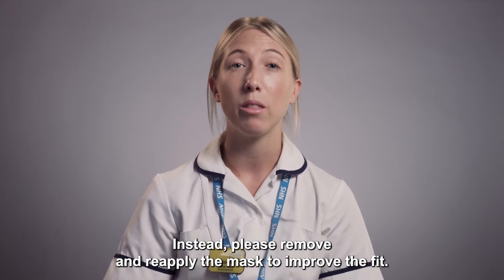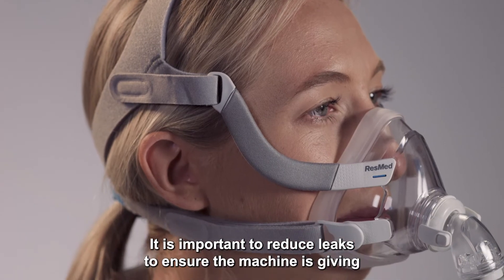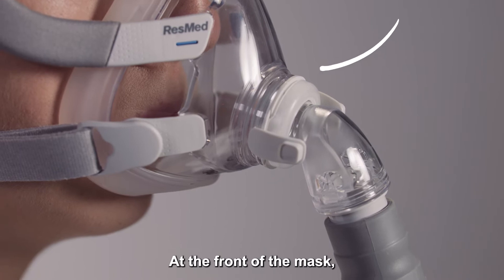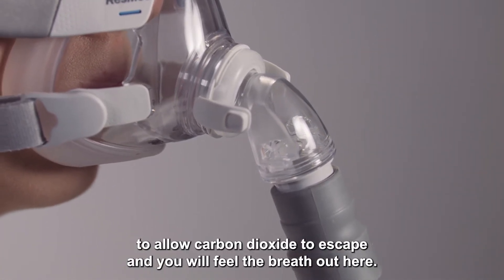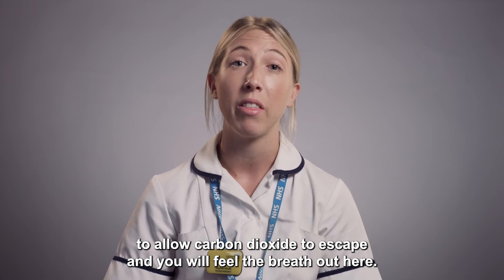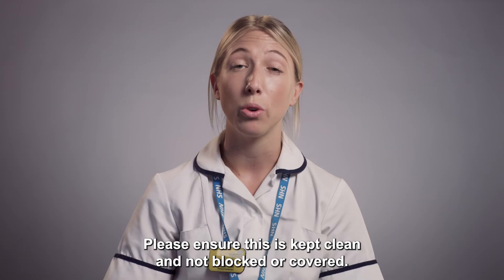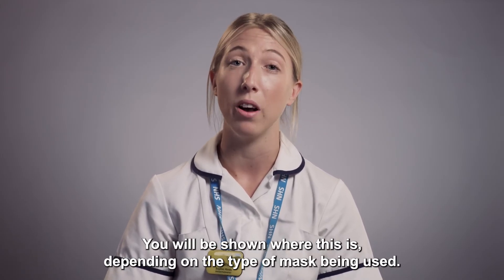Instead, please remove and reapply the mask to improve the fit. It's important to reduce leak to ensure the machine is giving the right size breath. At the front of the mask there is an exhalation port to allow carbon dioxide to escape, and you will feel the breath out here. Please ensure this is kept clean and not blocked or covered. You will be shown where this is depending on the type of mask being used.